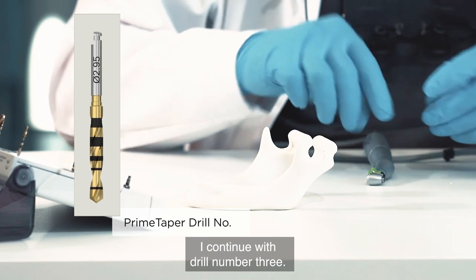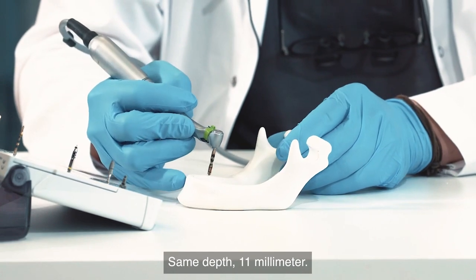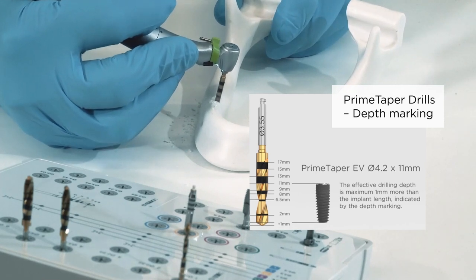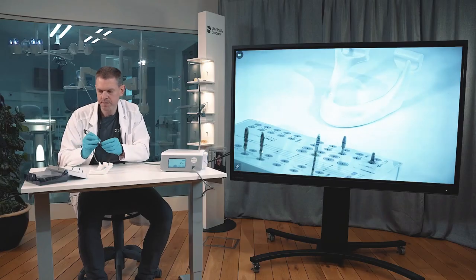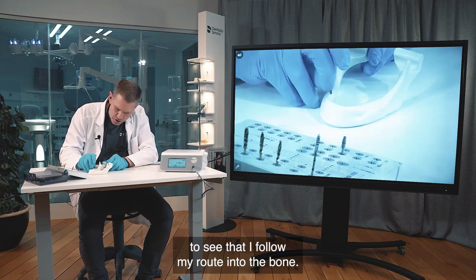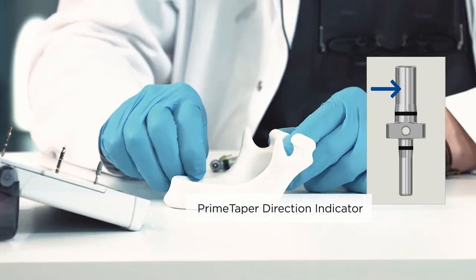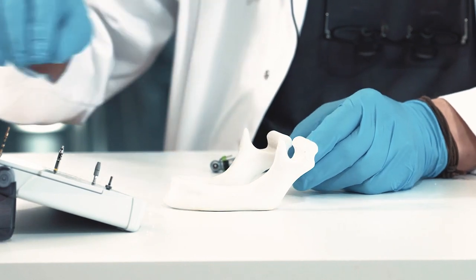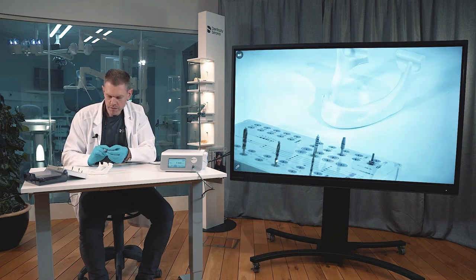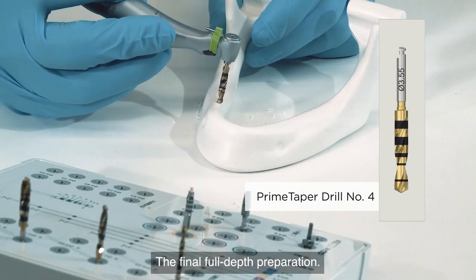I continue with drill number three at the same depth — 11 millimeters. I check again with the other end of the direction indicator to confirm I'm following my route into the bone. Then I proceed to drill number four for the final full-depth preparation.